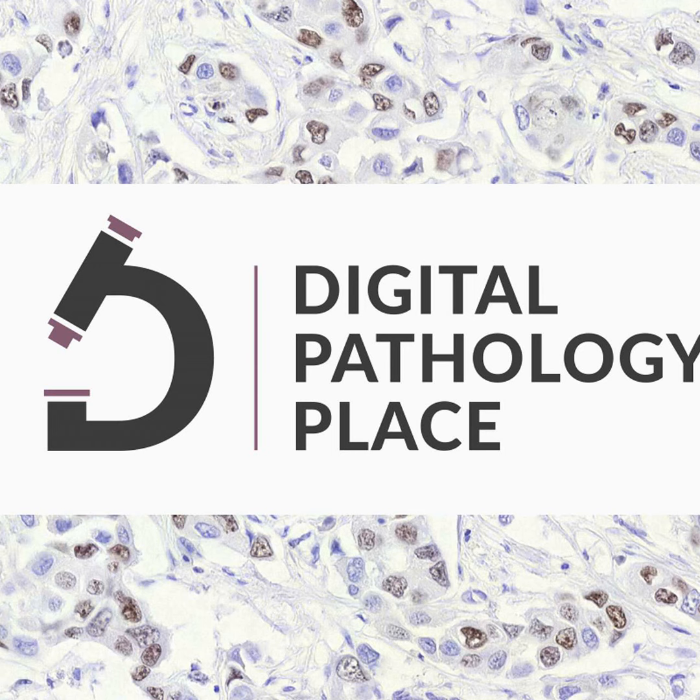Yeah, so what we then did was actually quite interesting. We combined the streaming approach with the CLAM model, so it's now called SCLAM. You have CLAM, but you can train it end-to-end. So you have the attention, and you can train the feature extractor and the classification part of the network at the same time, which was very nice, because we showed that if you combine these, so you have the optimal features and you have the attention mechanism, you can vastly outperform the original CLAM method.